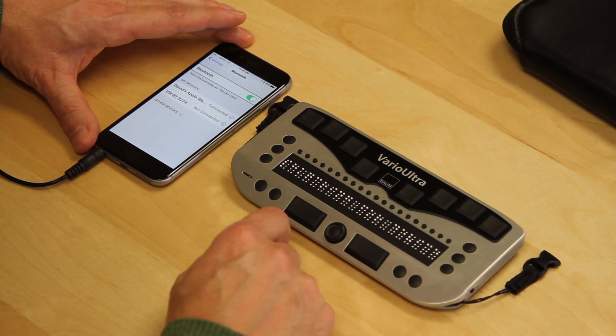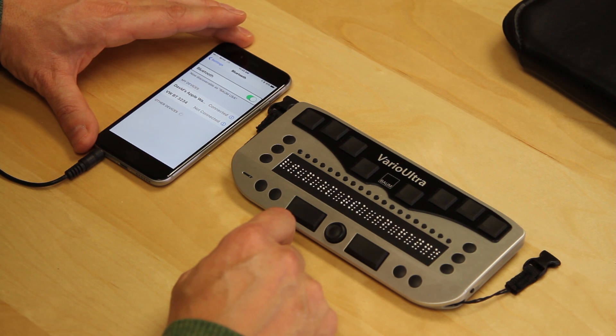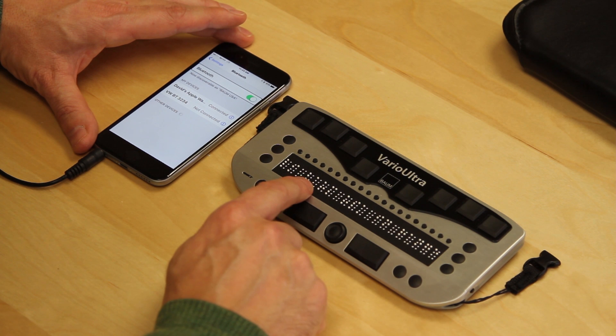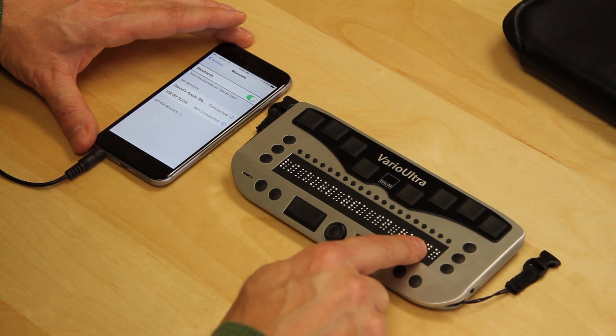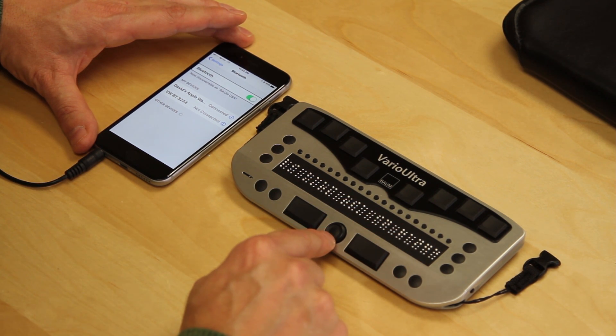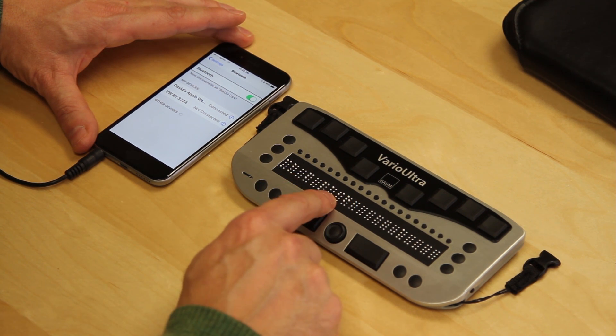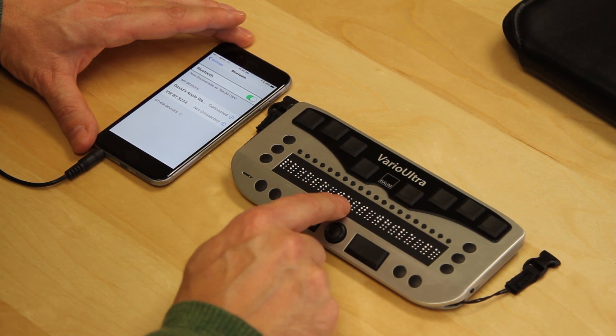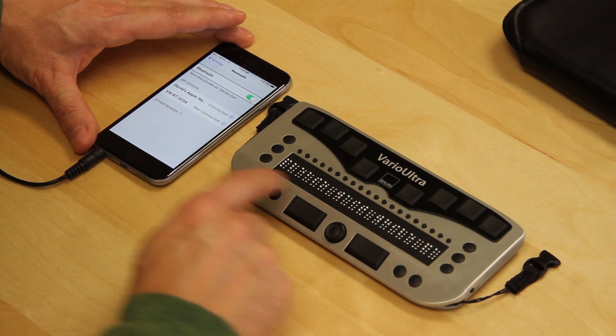It says that it's searching for devices and we're waiting for it to come back with an iPhone, the name of which is BaumUSA. I can see it's changed and as I read on the Braille display, it says BaumUSA in range. I now use the NaviStick to go down one line and we have the option to pair.